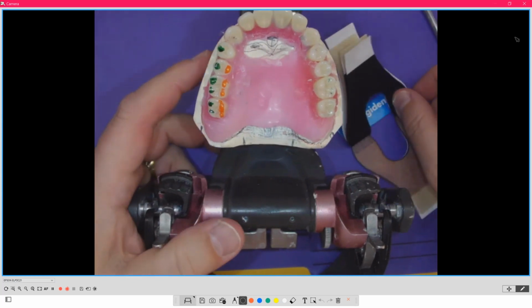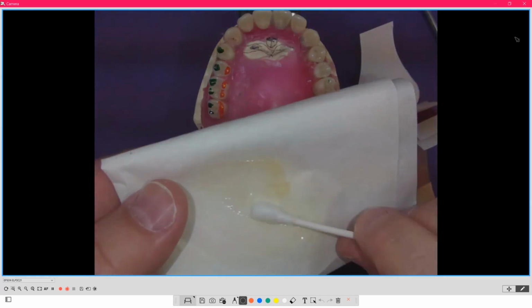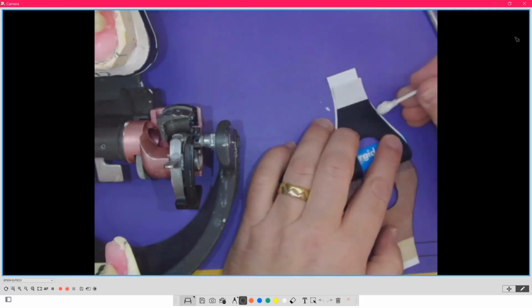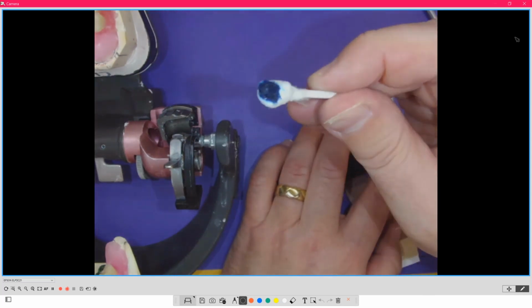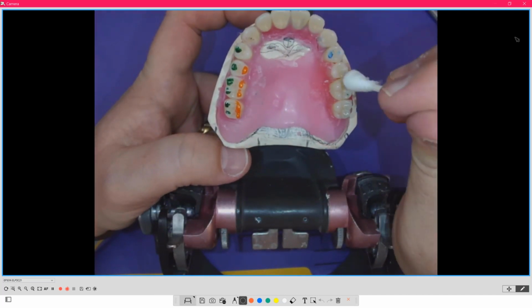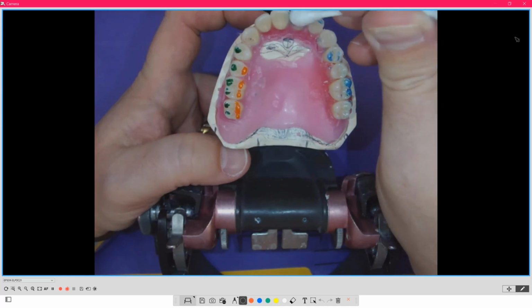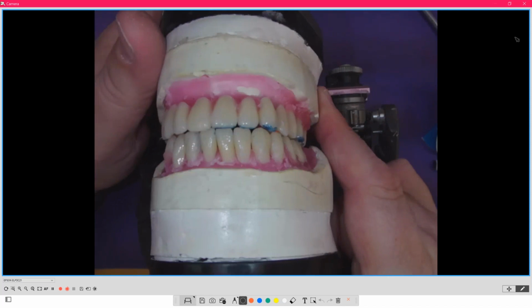So I have articulating paper here. I have a Q-tip, and I take that Q-tip and I coat it in Vaseline. And then I take the Q-tip and I rub it onto the articulating paper to impregnate the Q-tip with the dye. And then in the mouth, I would dry off the denture, and then I can come in and I can color things. So I can color the cusp tip, I can color here, I can color the anterior if necessary.